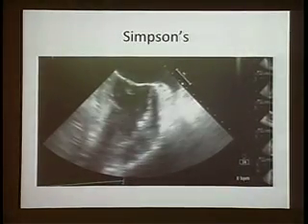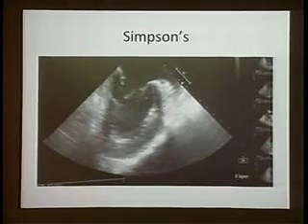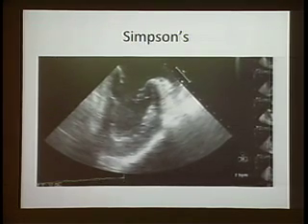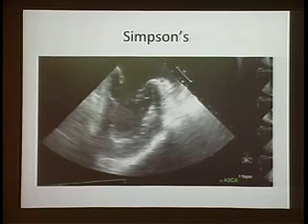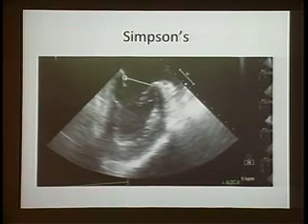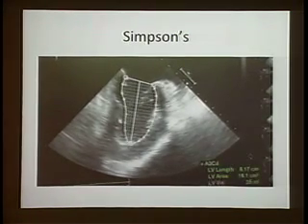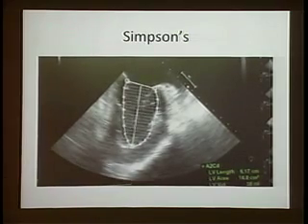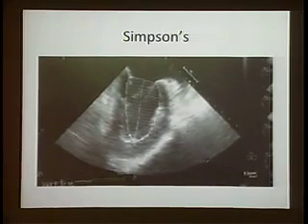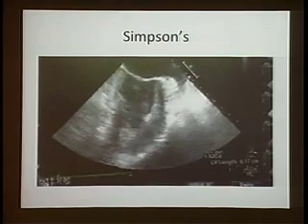And this is how you do it. You freeze your image, you go into a diastolic frame, you move your trackball until you get what you think is best. Then with your caliper, you put it on the hinges of the mitral valve, you drag the cursor all the way to the apex. You can then modify a little bit the edges, the endocardial edges, okay? And it gets you a volume.